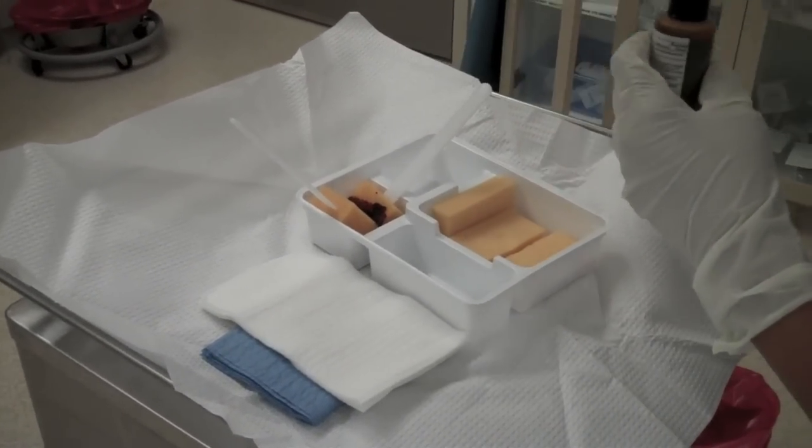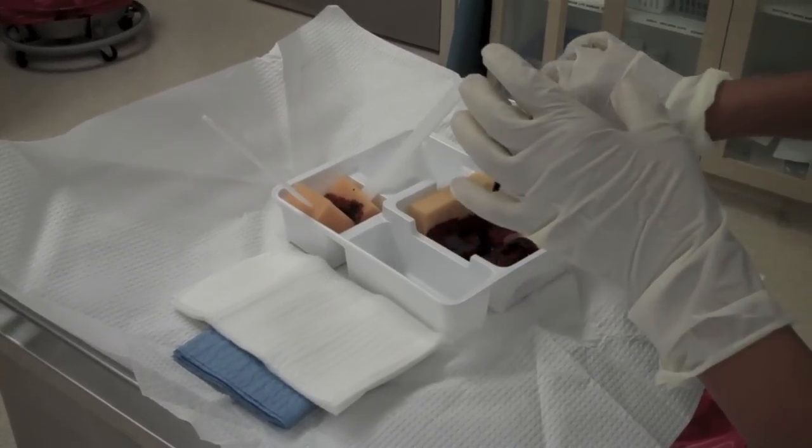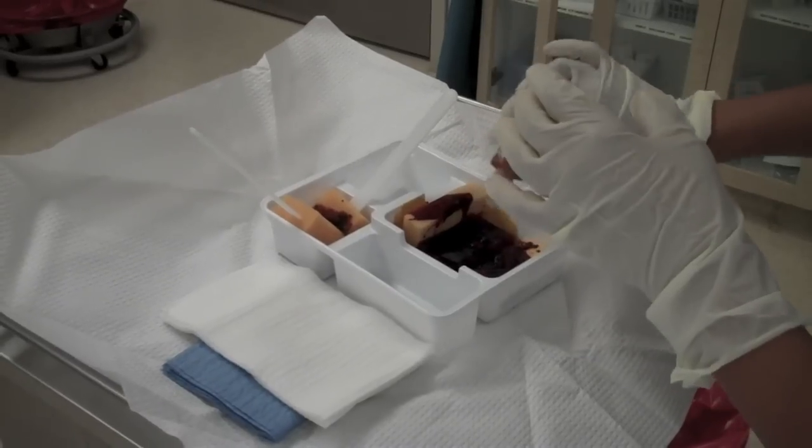For this prep there's a scrub and then there's a paint that's used in prepping. This is the paint — it's put on sponge sticks. The scrub is put on sponges that we scrub the foot with first.